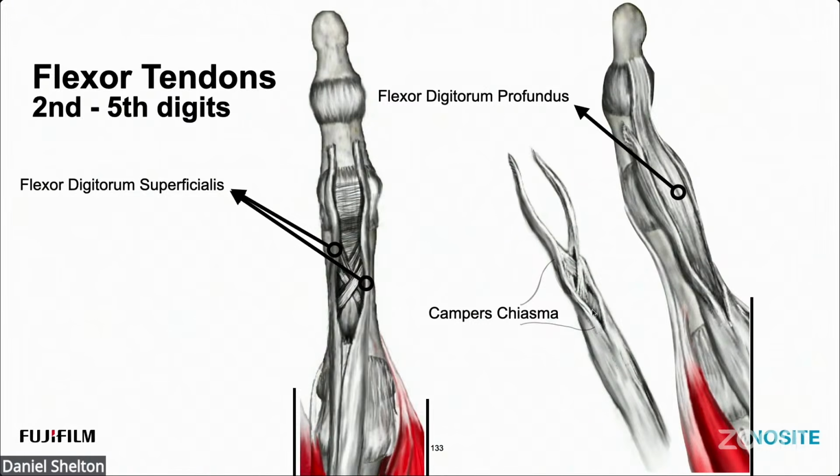They also hold the flexor digitorum profundus. So you can see the deep part, or the profundus portion of flexor digitorum comes out from between the split of the flexor digitorum superficialis and keeps headed over the PIP and then over the DIP to insert at the base of the distal phalanx. And that web here between the two heads holds that profundus into place.